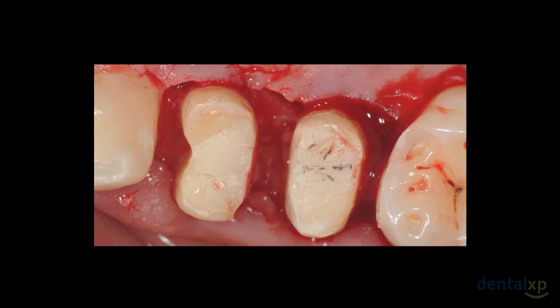As I told you, I previously did a video on molars, and you certainly can pull that video up and look at how we handle molar furcations and how we address the removal of the furcations. In this case, the periodontist should have been working on the line angles, and instead he worked in the concavity, creating a worse environment. The arrow clearly shows the deep concavity we presently have now that actually was created by the burr of the periodontist.